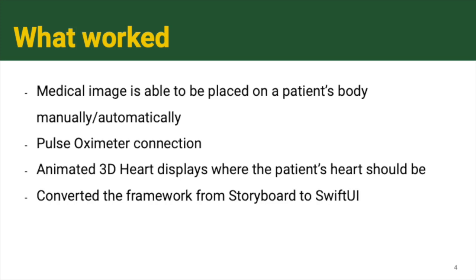We found that by switching back and forth with different configurations, from body tracking to world tracking and vice versa, we were able to achieve the best of both worlds. As LiDAR technology only works with still images and not body tracking, first, we designed it to enable the body tracking functionality to gather the points for anchoring the image. Then we map the image in the world tracking functionality to utilize the LiDAR technology.